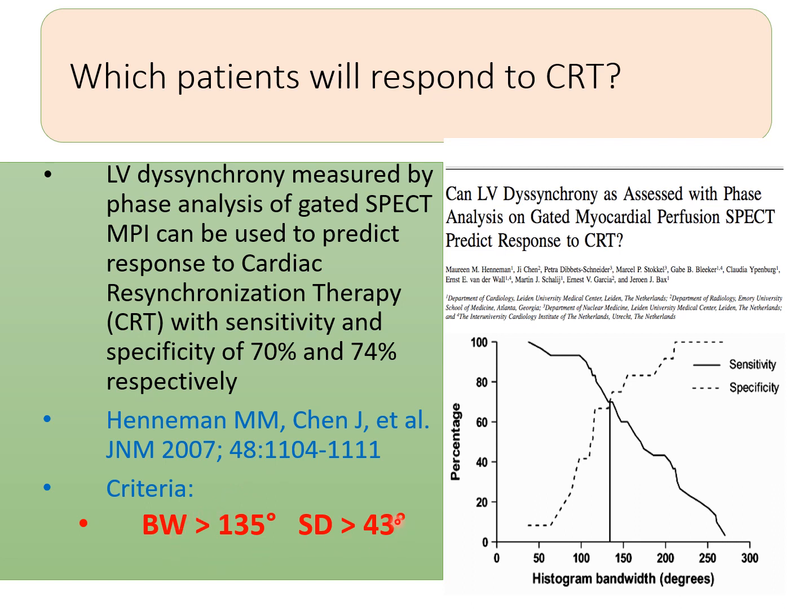Now, even though we found the best cutoff, and this was retrospective, still about 30% of patients didn't respond according to these parameters. And so we had to keep looking. Synchrony alone is not enough to predict who's going to respond.